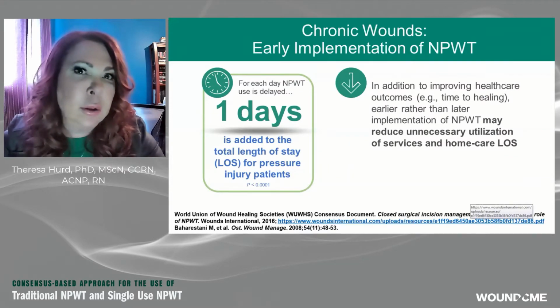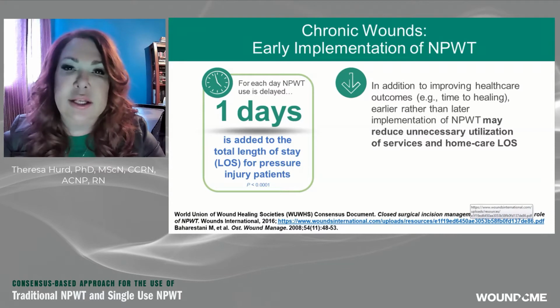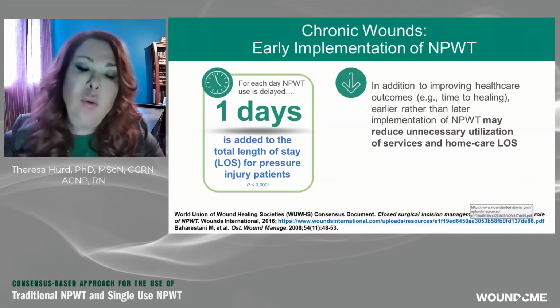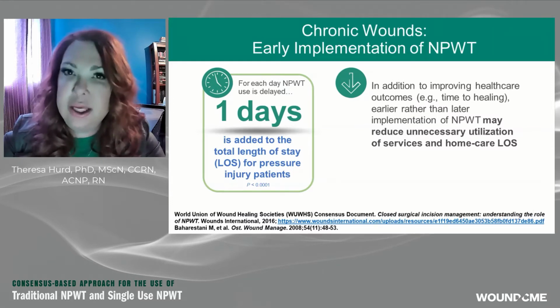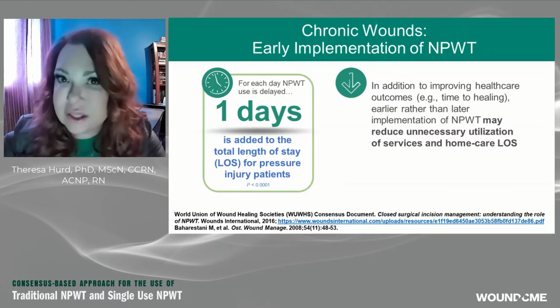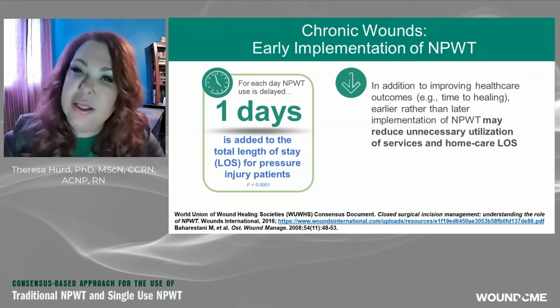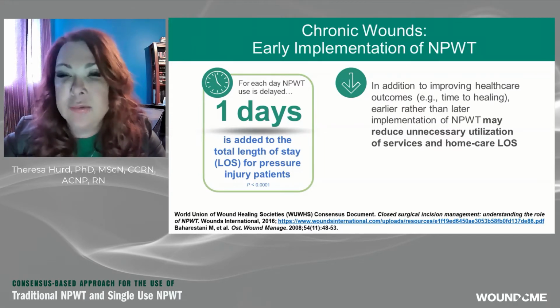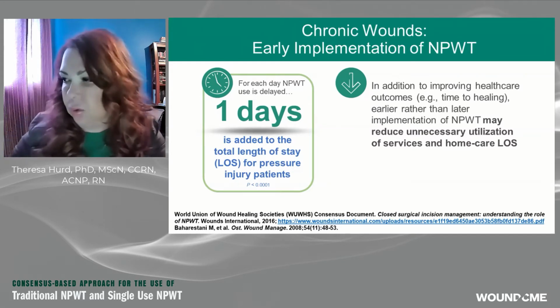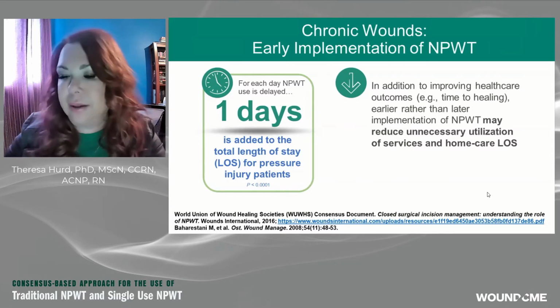Why is this important? Well, one of the things we want to do when we take care of chronic wounds, as I've alluded to, is to get our healing times as quick as possible to avoid any other issues for that patient. And we have found that if we start negative pressure early on, we not only have healing times improved, but in fact, we decrease length of stay in the hospital. So again, these are really important things to start to look at when we look at chronic wounds. No longer do they kind of sit out there by themselves.